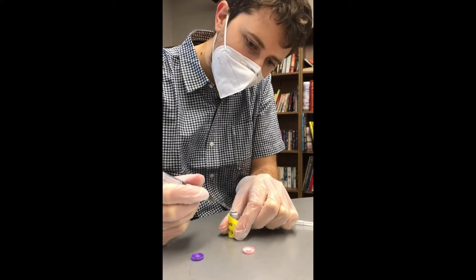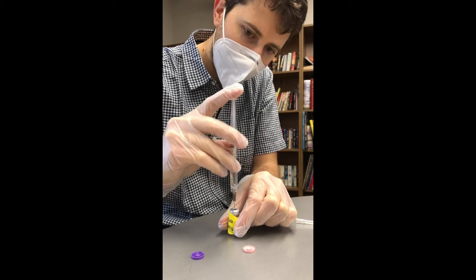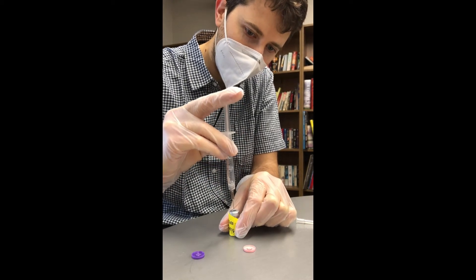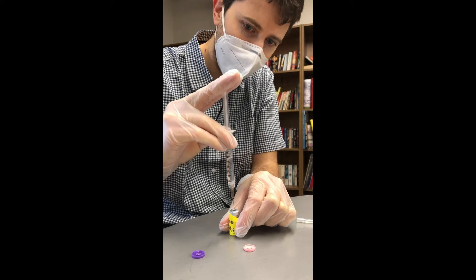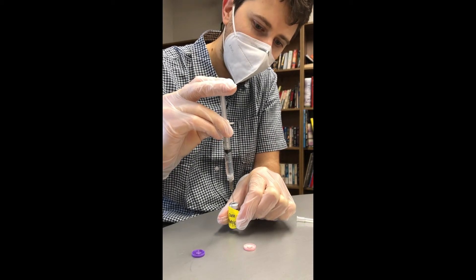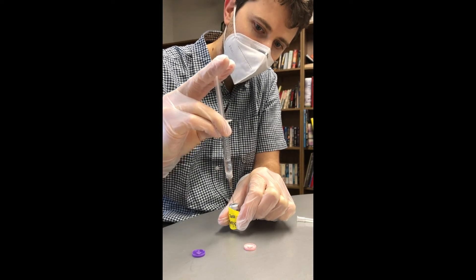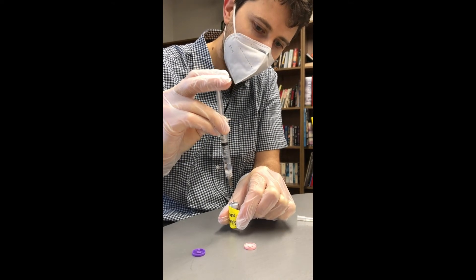And I put it into the actual vaccine vial. Now, before I even push on it, I actually prefer to just draw up some air. Then I push it down. Then I pull it back up. Then I push it down again.